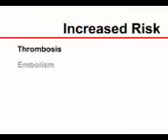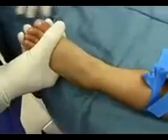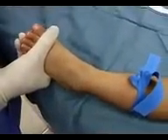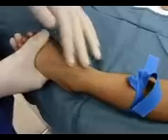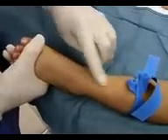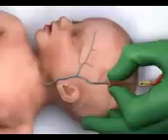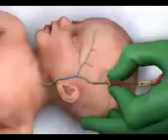incidence of thrombosis and embolism as compared with upper extremity veins. This risk is lower in children and infants. Therefore, the veins of the legs and feet are an acceptable alternative when cannulation of the upper extremities has failed. Other alternative intravenous cannulation sites include scalp veins, used in neonates and young infants, and the external jugular vein.